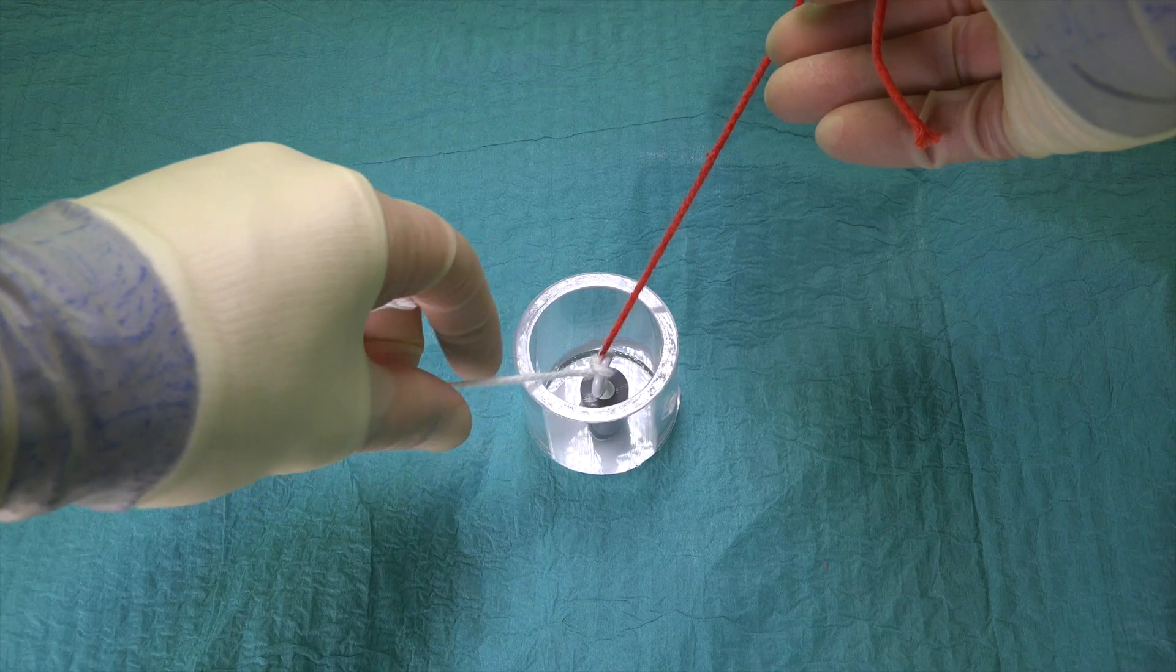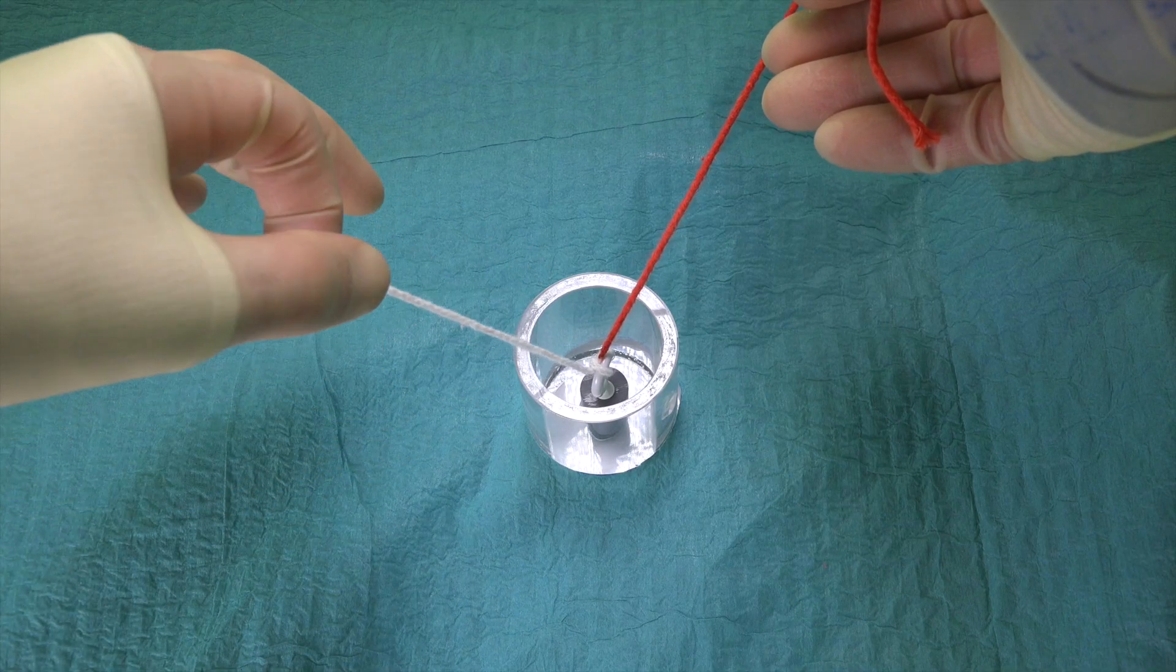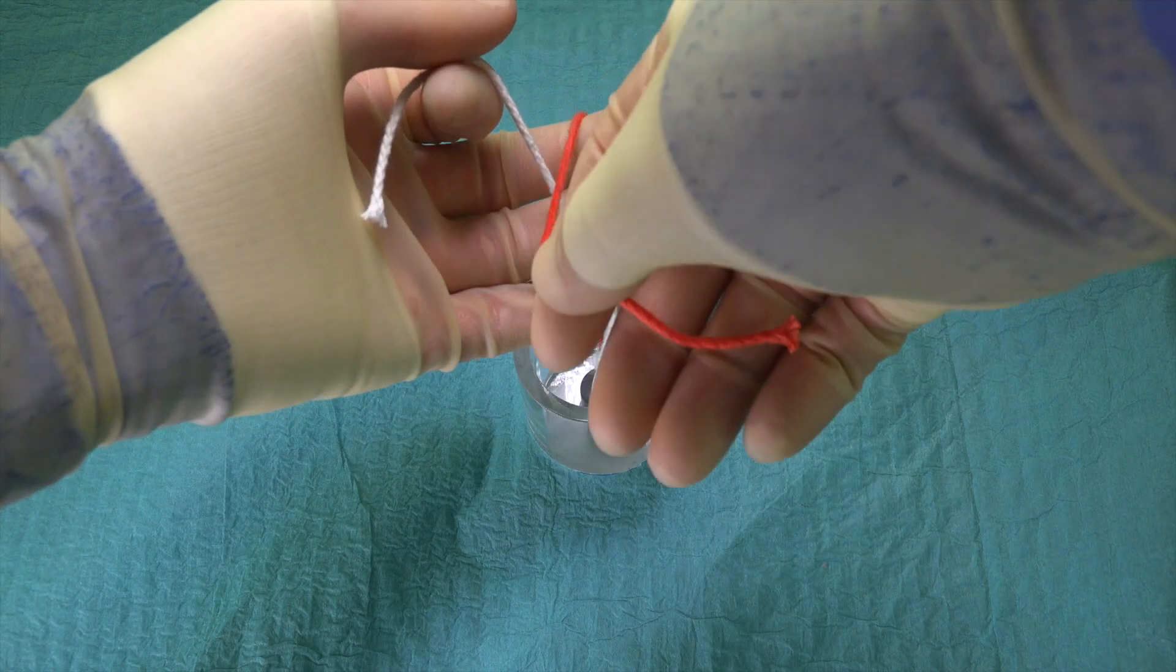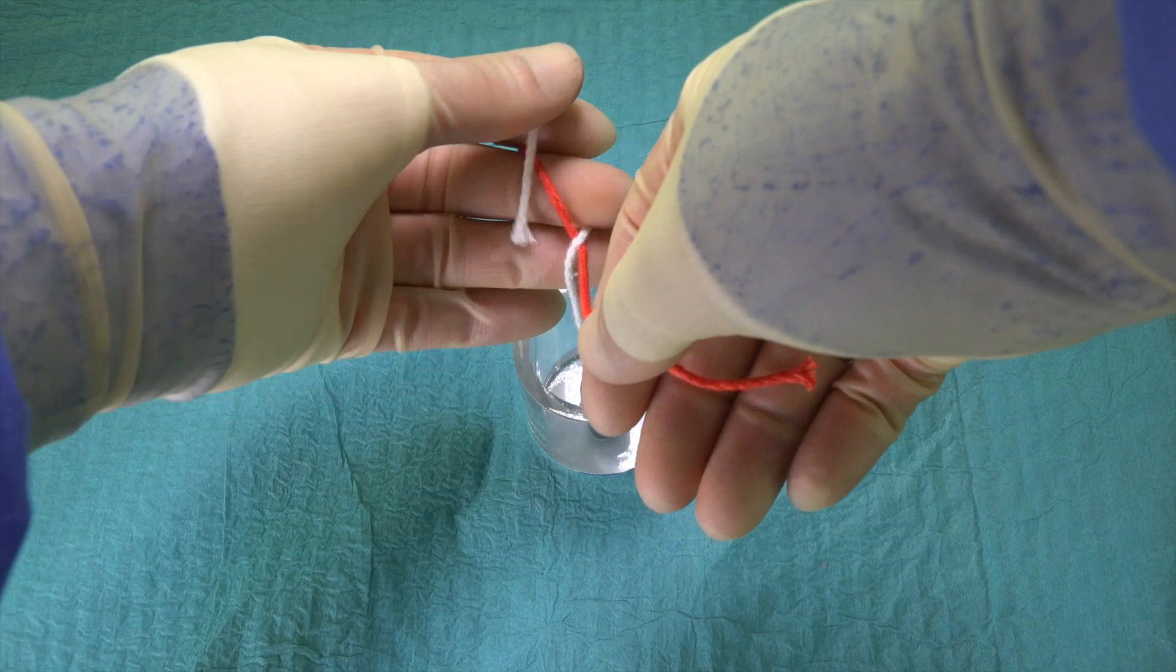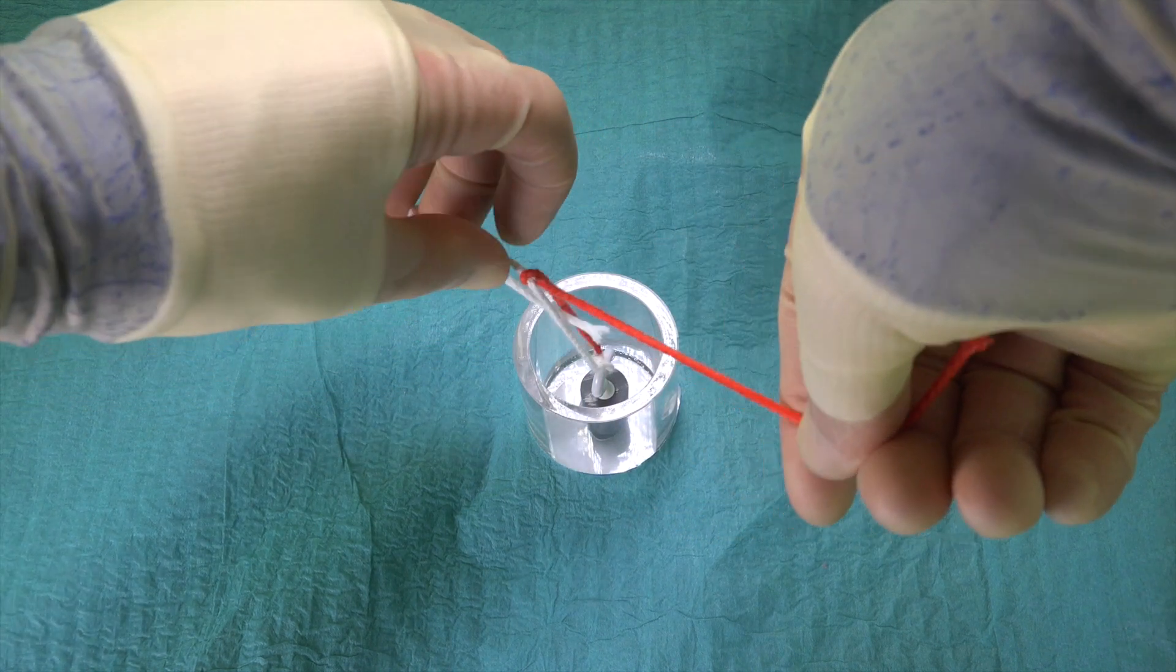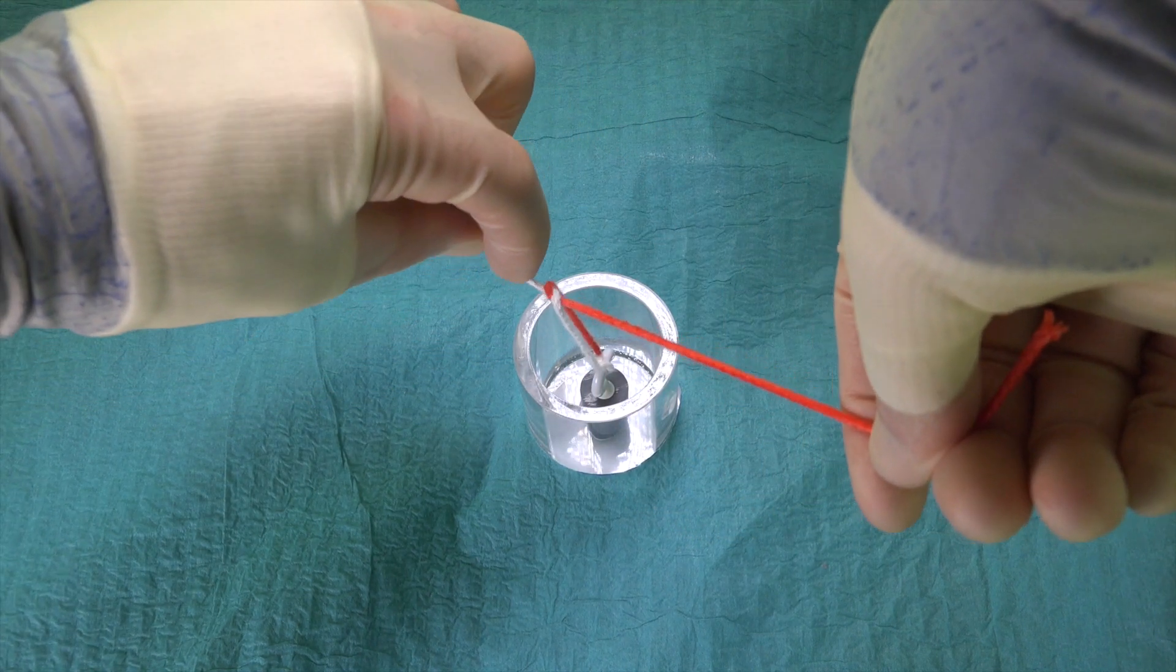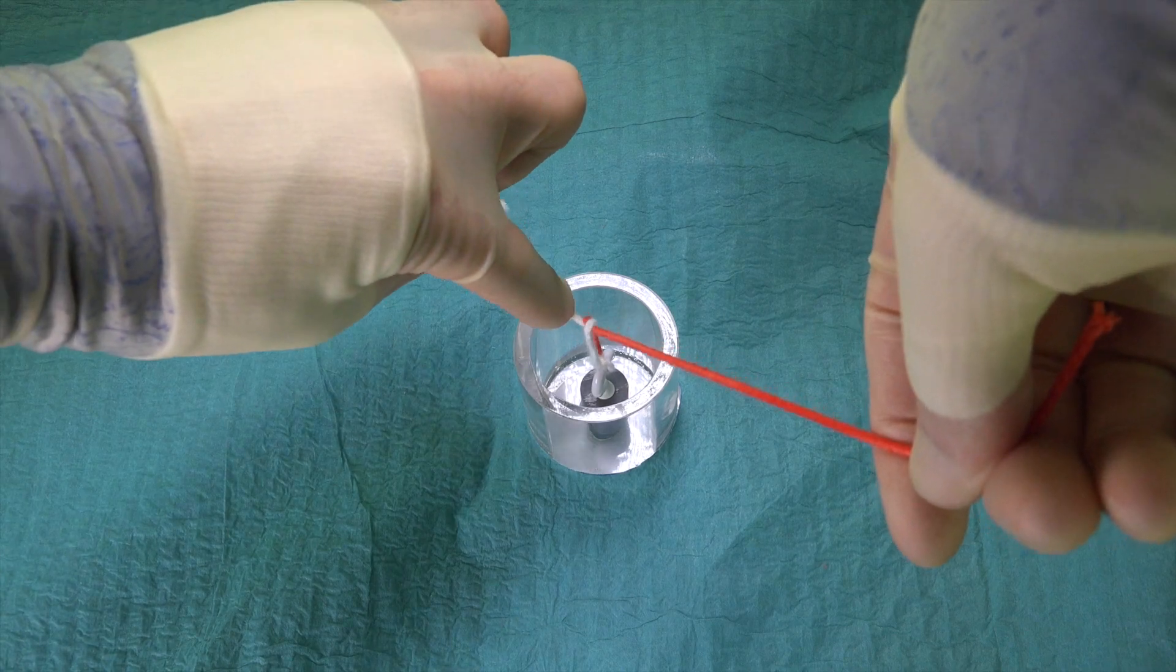For the second throw, the left hand changes to an underhand position, and the same movement is carried out as we would for a normal hand-tied reef knot. The right hand is then moved slightly towards us and maintains gentle upward traction on the suture. This prevents the knot from loosening between throws.